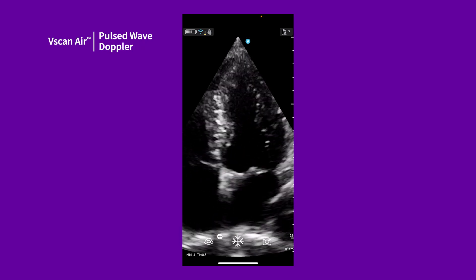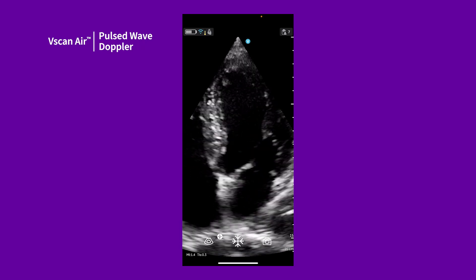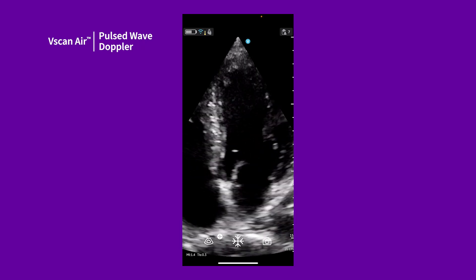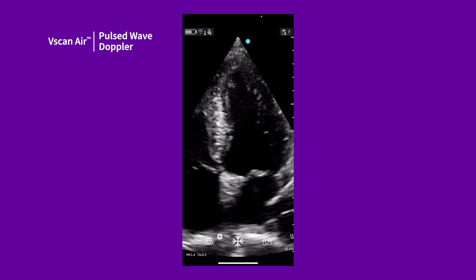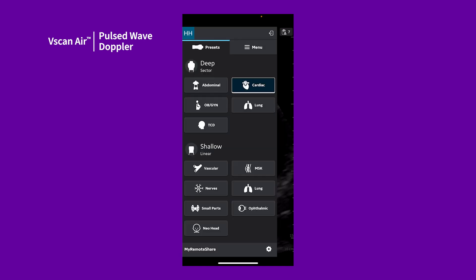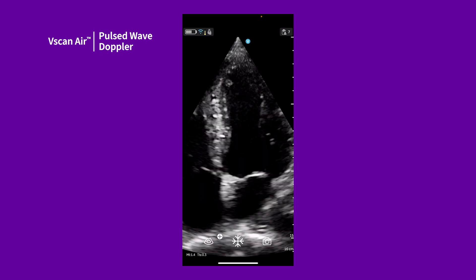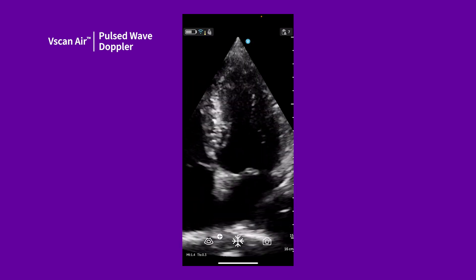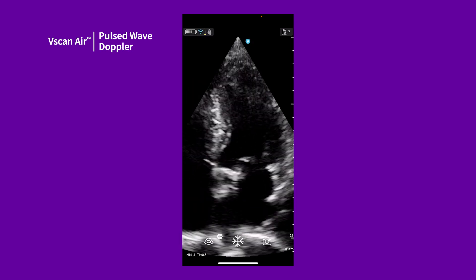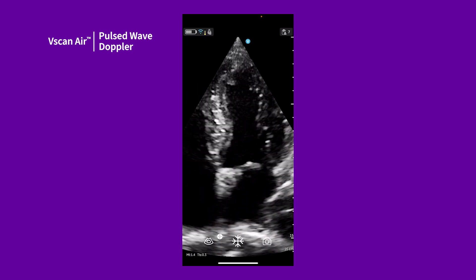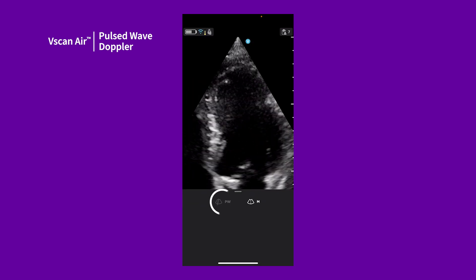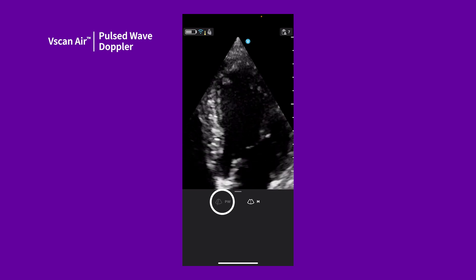Pulsed Wave Doppler allows you to measure the velocity of blood in a sample volume. After you've chosen your preset — for example, we'll use cardiac — locate the anatomy. Note that you will not be able to access PW mode unless you are first in color.